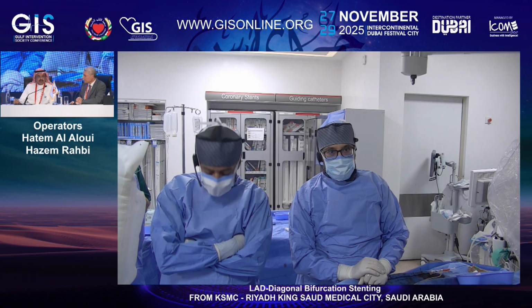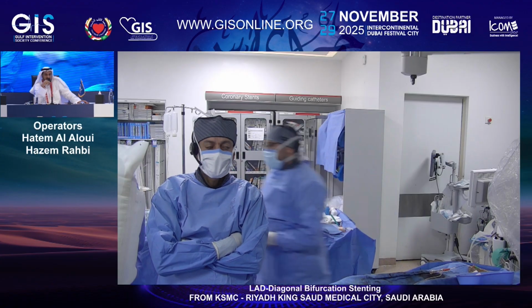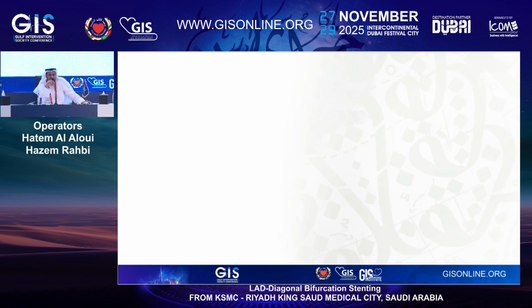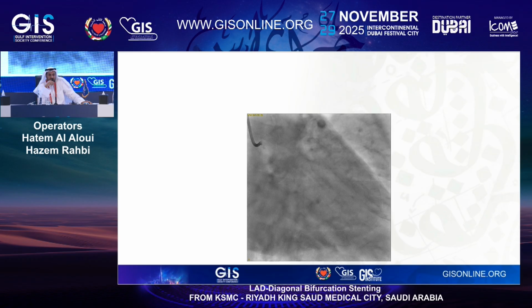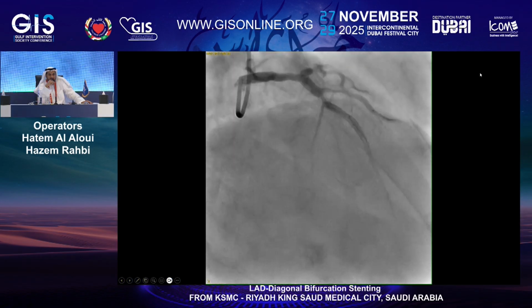Sorry, Dr. Hatem, can you put the vertical view of the LAD? Can you go back to the cranial view? Back, Hazem. You can show the angio. Yes, full screen. Now run it. Just keep it running and we'll discuss.